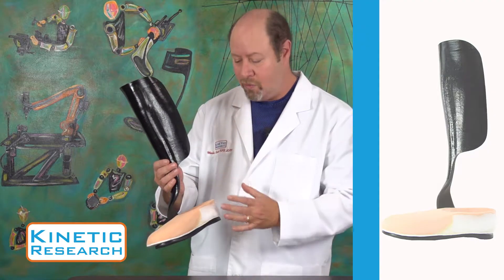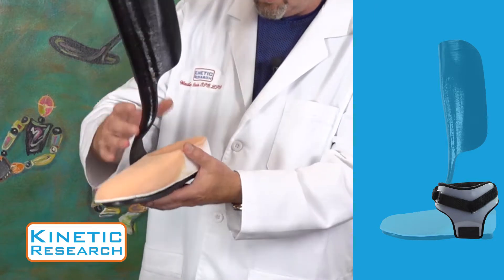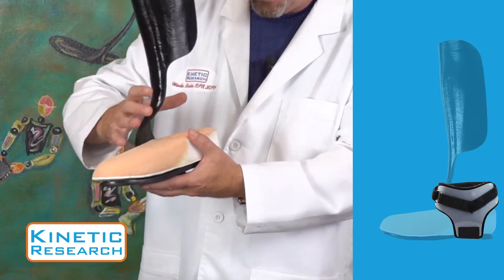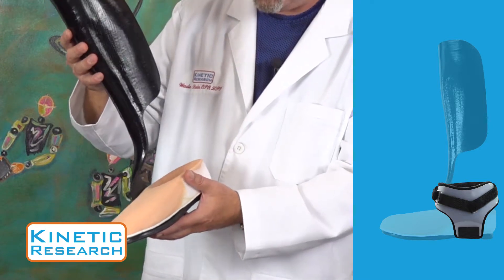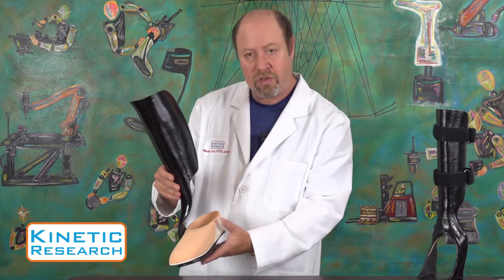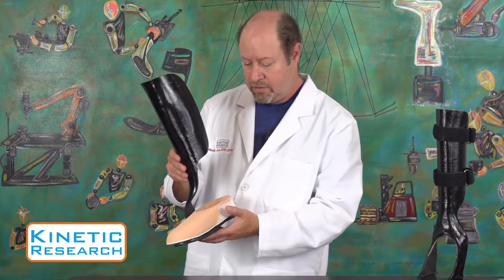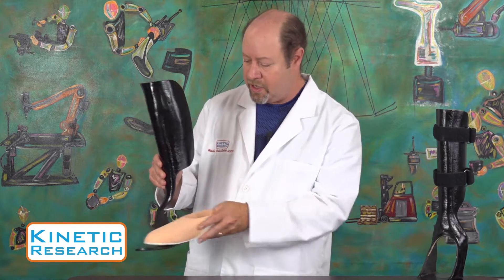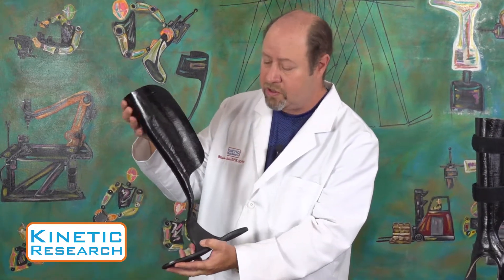It comes standard with a T-strap which locks on to the lower ankle and holds the patient in position inside the device. The toe filler fills out the shoe so it doesn't look obvious that there's nothing in there. But the real action is up here in our carbon strut which directly goes into the foot plate.